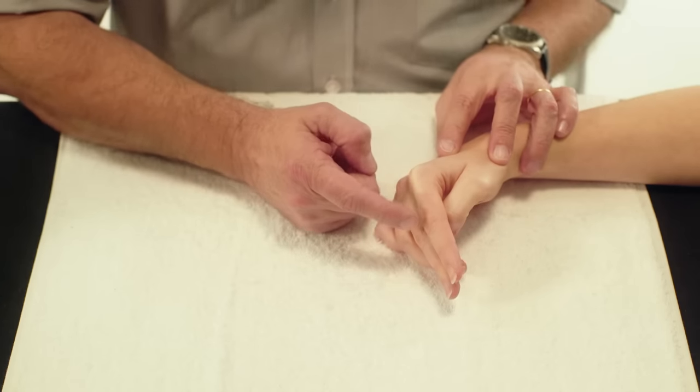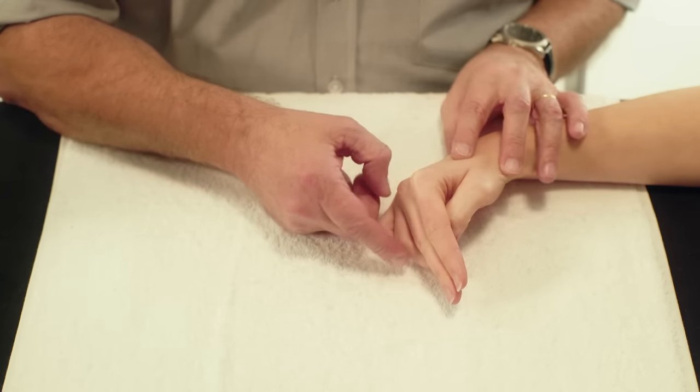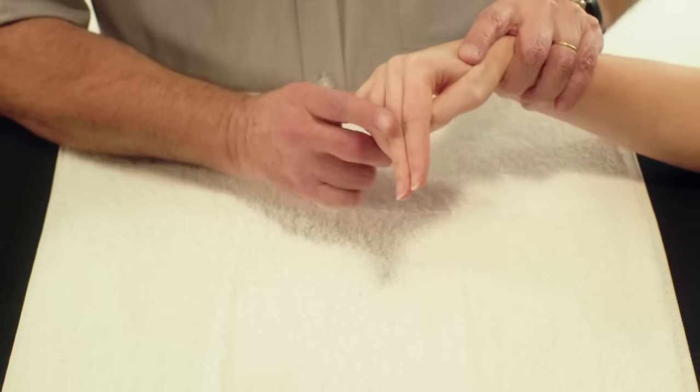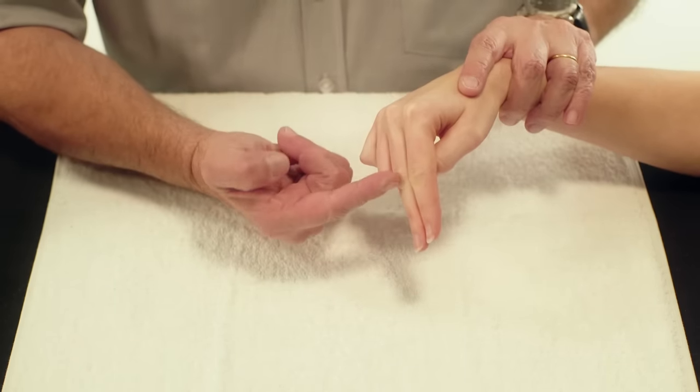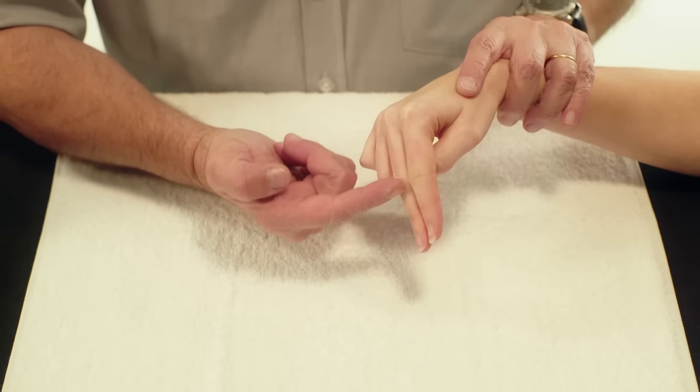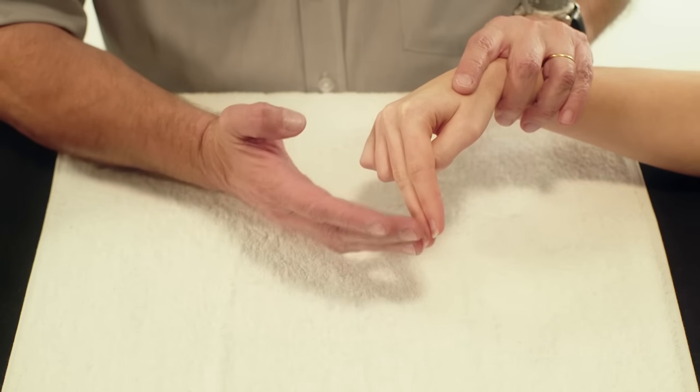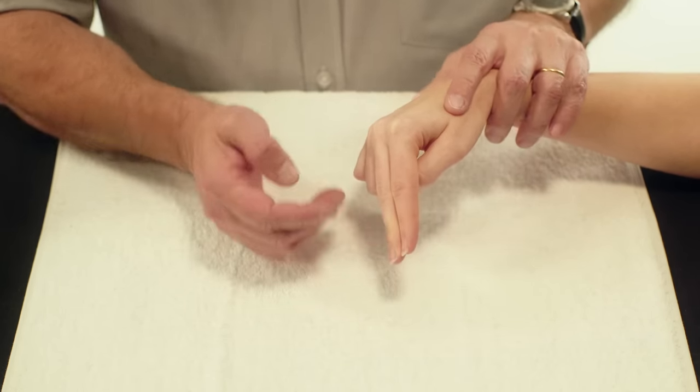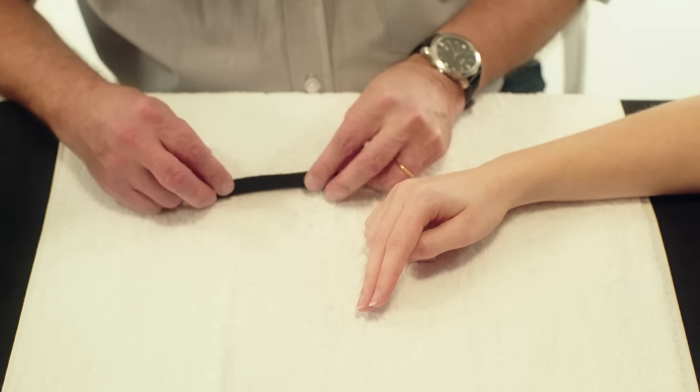Before moulding, make sure that the MCP joints of the concerned fingers are in flexion. This ensures that the PIP joints are at the same level while moulding. Fold the Orphicast in half lengthwise.